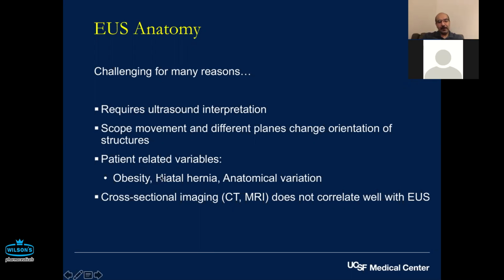Obesity, abdominal fat can have a role. Hiatal hernias, getting the scope stuck in there can be a challenge. There can be variations in the anatomy, the duodenum or the stomach, or the GE junction. All of those little variations can make visualization, what should be straightforward, difficult.